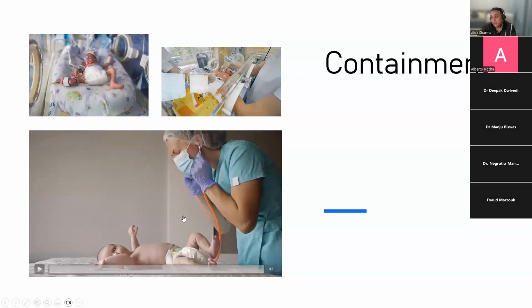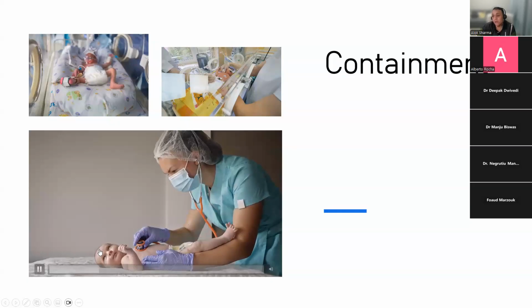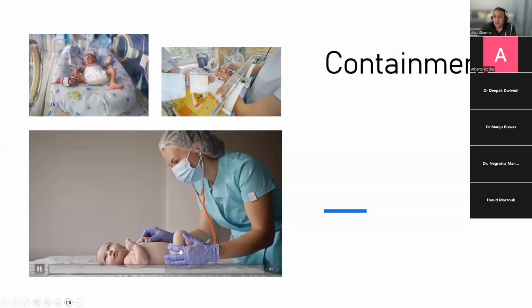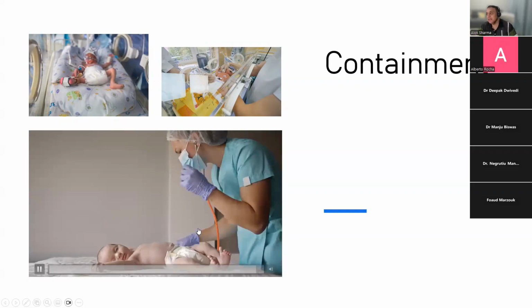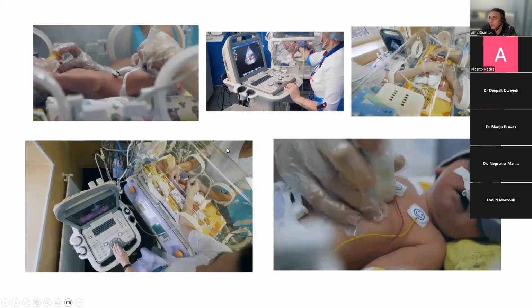And really, how am I going to find that out? Well, I examine him. I've gone through his notes, his history, his clinical trends, I've felt his fontanelle, I've looked at his blood pressure, I know what his perfusion is like. Maybe he needs an urgent blood transfusion first. So small things like that: you always examine your babies, and that's always best done before you start your scan, because otherwise you're missing out on vital clues.